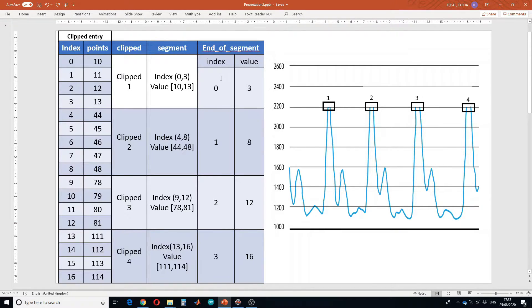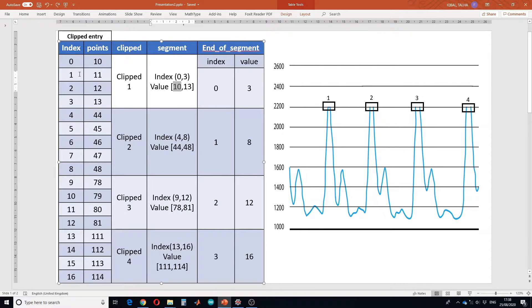The length of this loop will depend on the number of entries in the end-of-segment array. Here it is four because we have four clipped signal segments. The value of the first clipped signal is 10 and 13, which are entries in the clipped signal at the first column first row and first column fourth row. To generalize this, we use the end-of-segment array, so the first segment will be between clipped entry first column first row and the row whose value equals the first entry of the end-of-segment array, which is three.